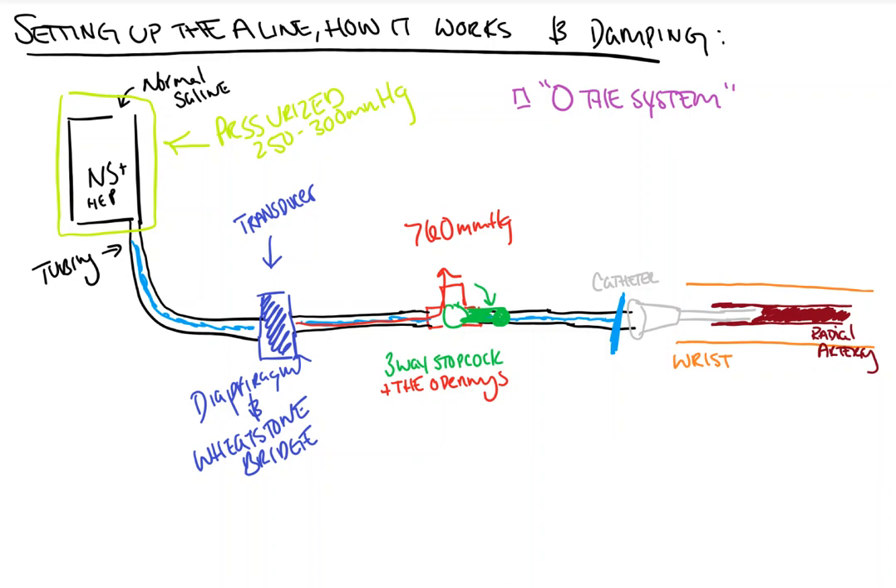This allows the transducer and the system to normalize to normal atmospheric pressure. Now, we commonly zero the arterial line at the level of the right atrium — and to be honest, I'm not exactly sure why. At the time you're zeroing, you're exposing the arterial line transducer to atmospheric pressure, and it shouldn't be any different if you're at the foot or at the head of the patient, so long as you don't expose the transducer to the patient's blood pressure during that time. Theoretically, zeroing at the patient's head should be the same as zeroing it at the level of the heart — but I encourage you to try it and let me know what happens.